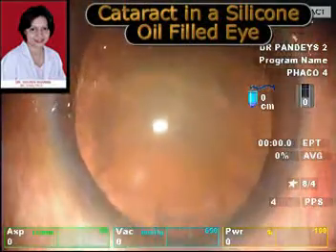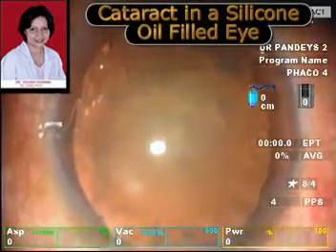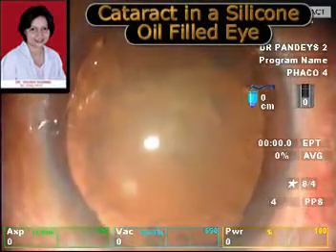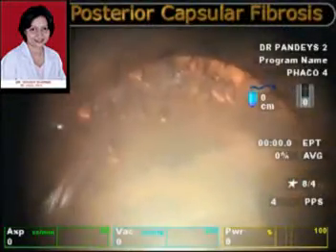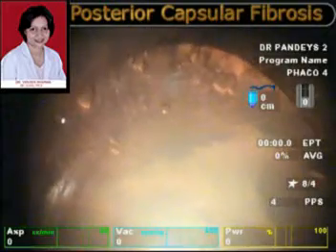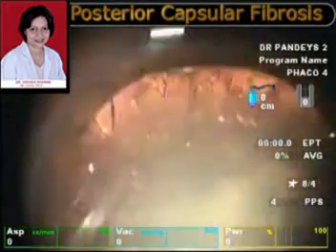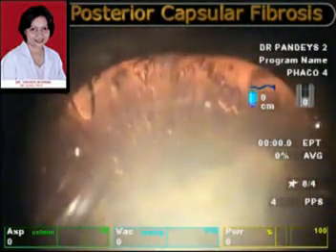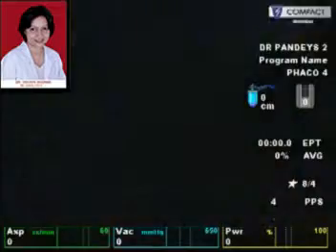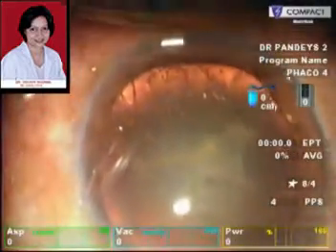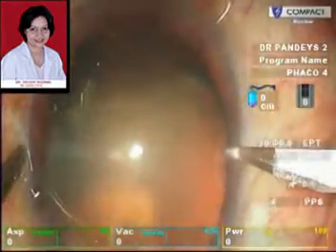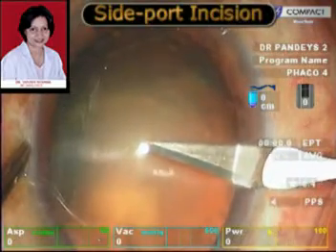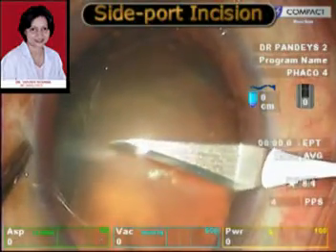This is the posterior subcapsular cataract in a silicone oil-filled eye. As we all know, the posterior subcapsular cataract occurs in a large majority of eyes that have had silicone oil implantation, and even after silicone oil removal the cataract may present and progress rapidly. In these eyes, posterior capsular fibrosis occurs and may create problems.